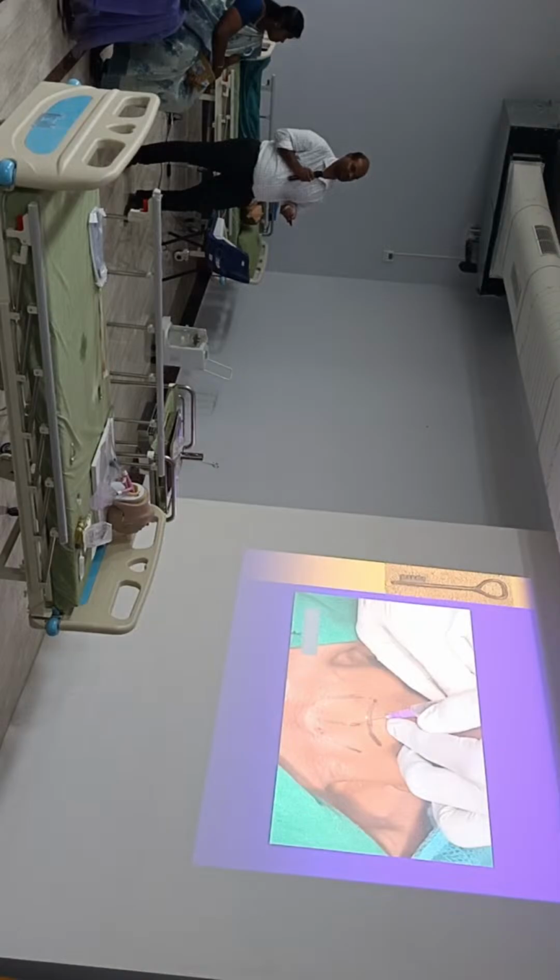The infiltration will be given so that the bleeding around where we make the incision will be less. Second, I have my own technique where we insert directly into the trachea to see how much the depth is.